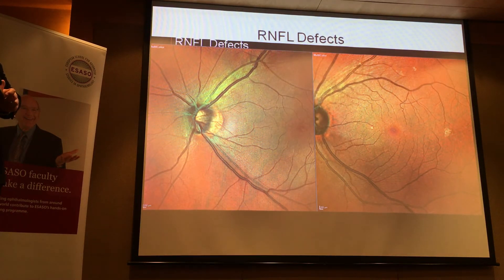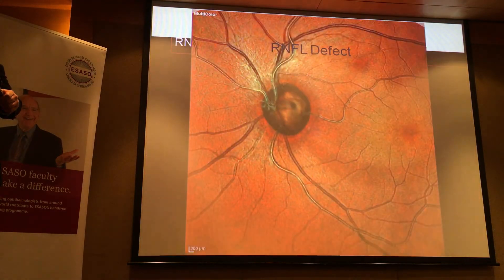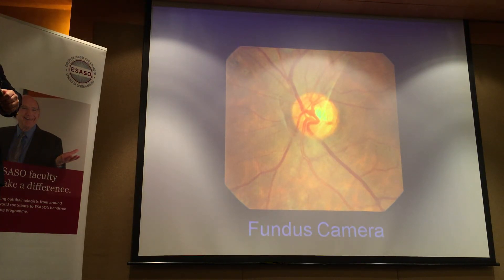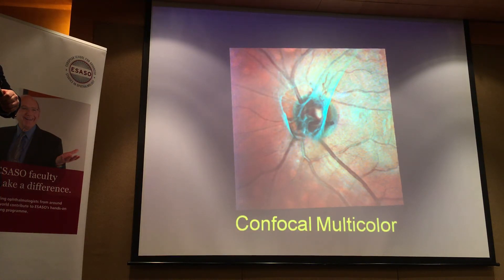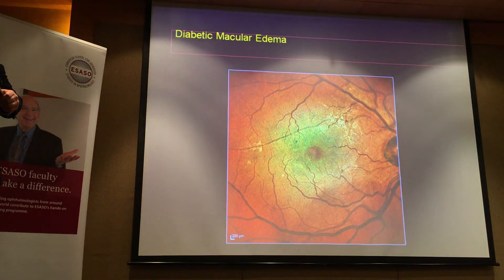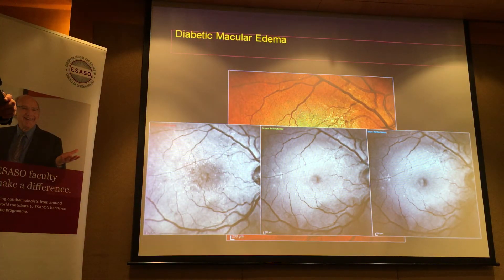For glaucoma — so they don't feel left out — you can actually see nerve fiber layer defects on multicolour, particularly on the red-free and green channels. For diabetic maculopathy, the macula appears greenish and you can see the microaneurysms. OCT comes in helpful here too — you can see the different layers, but notice some hemorrhages appear blocked, especially on the blue channel.